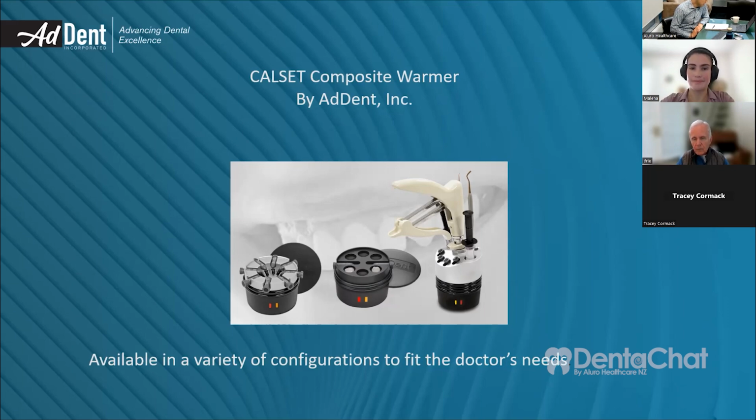Awesome, great. And another question is, I know you have a list of the dispenser guns that you have that they will fit, and also compules and syringes. Is there any particular range that you know for sure that it won't fit, or any particular gun dispenser that it won't fit, that you have come across in the past? Well, I can't... they change all the time.